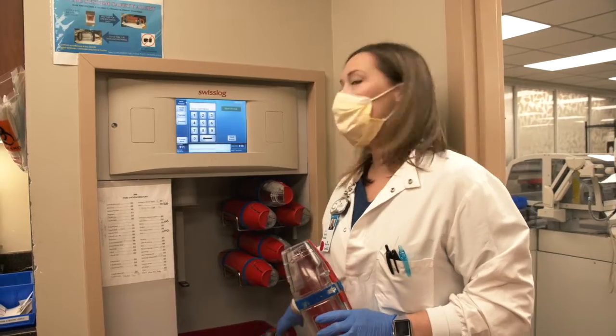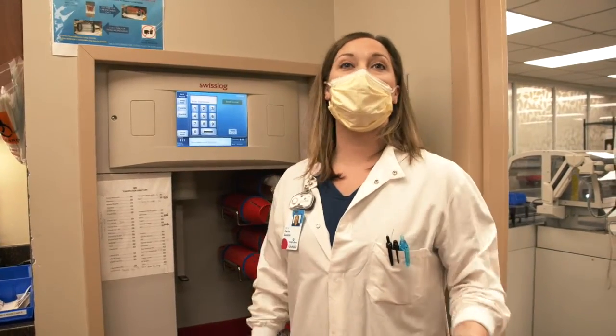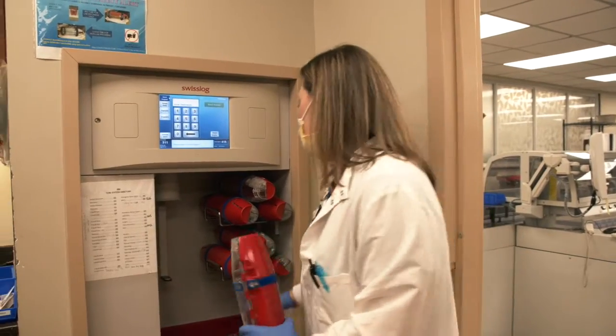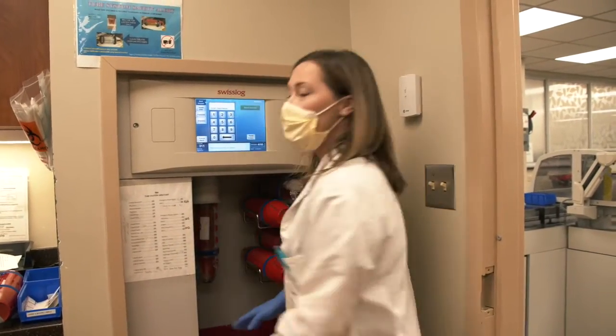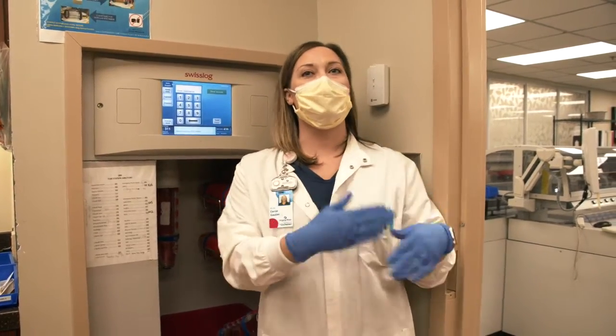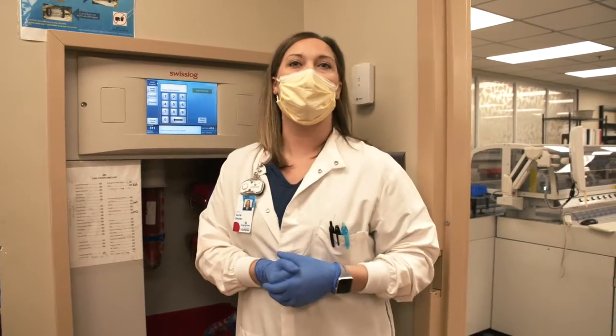Now, until we open these tubes up and check what we have, we treat all specimens as stat until we can get the tube in hand and learn how to prioritize it. So we don't ever want anything sitting here. This tube station's manned at all times, and we always have someone in here working, processing, checking the specimens in, and delivering them to the departments.